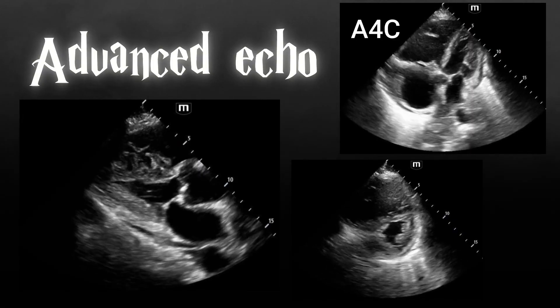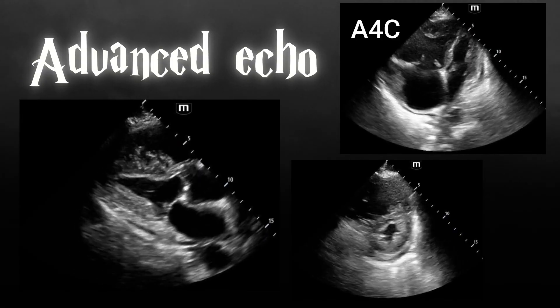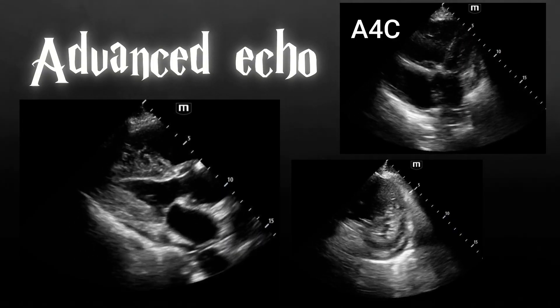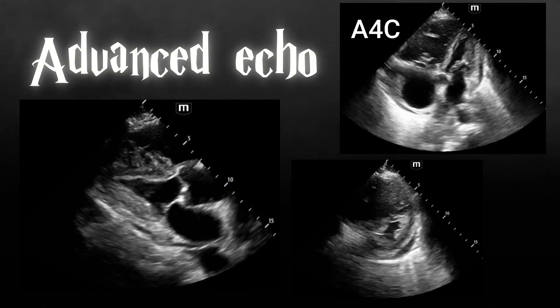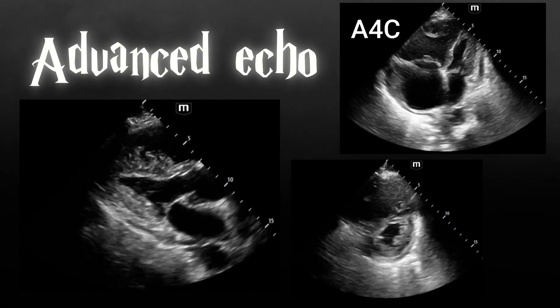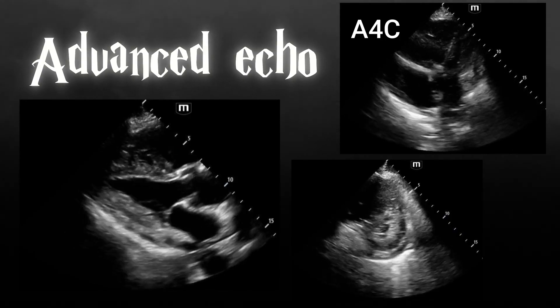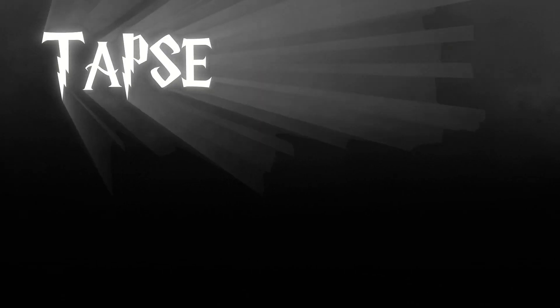If we look at the heart in the apical four chamber view, we'll notice that the RV is very large — bigger than the LV — it's severely dilated, and the function is compromised. When I mention that the patient's RV function is compromised, what do I mean?